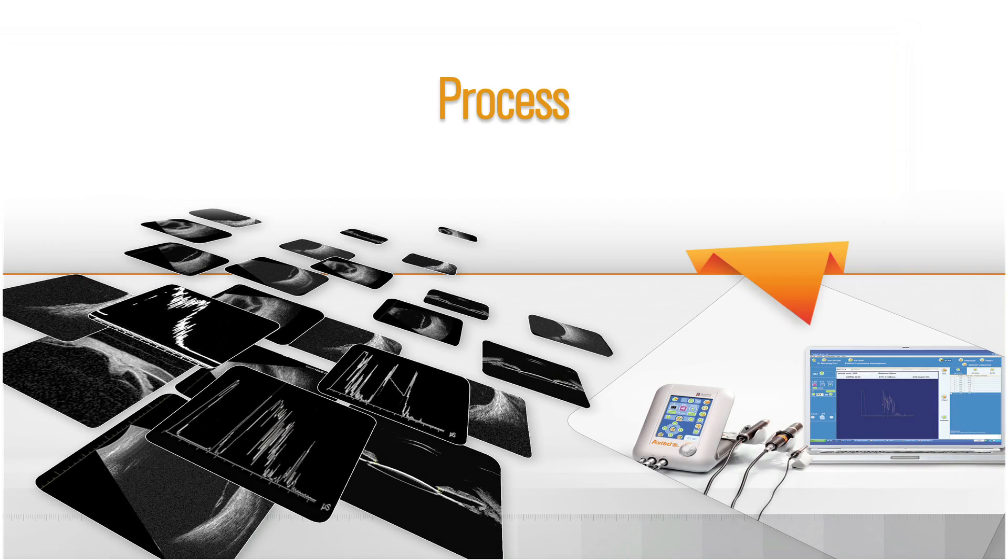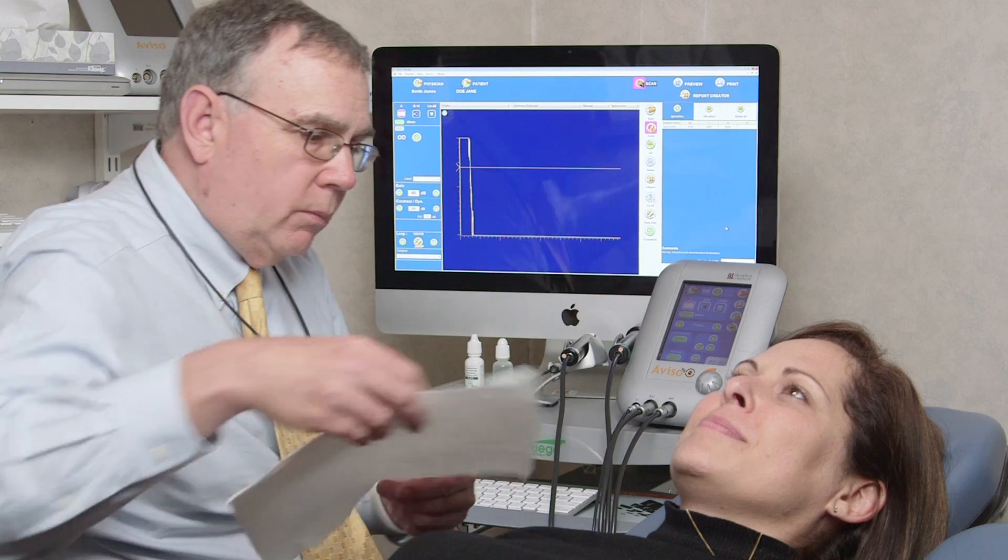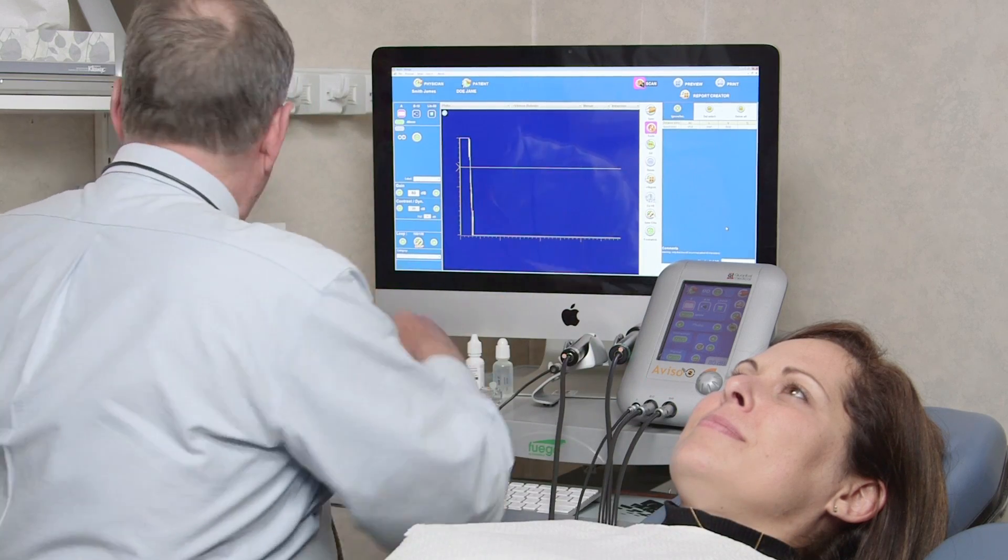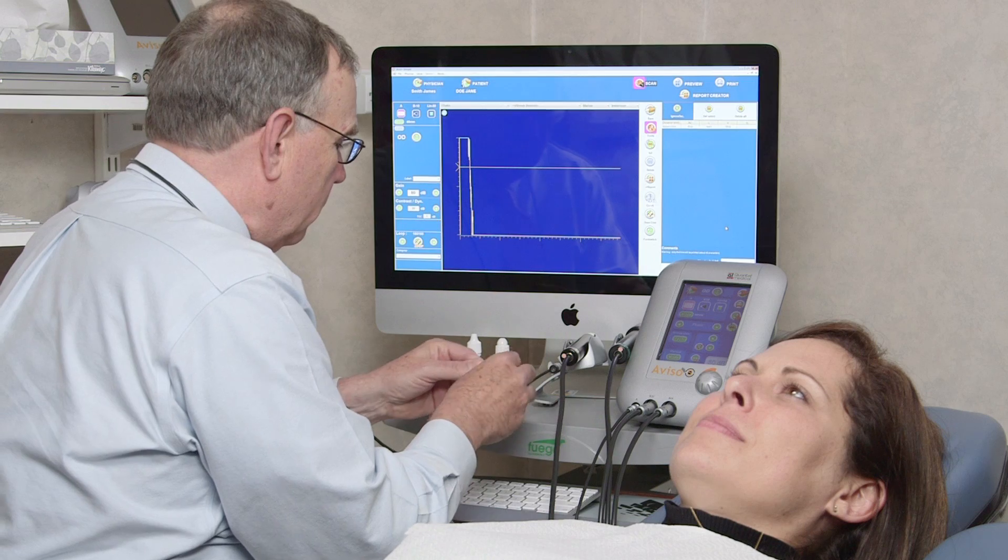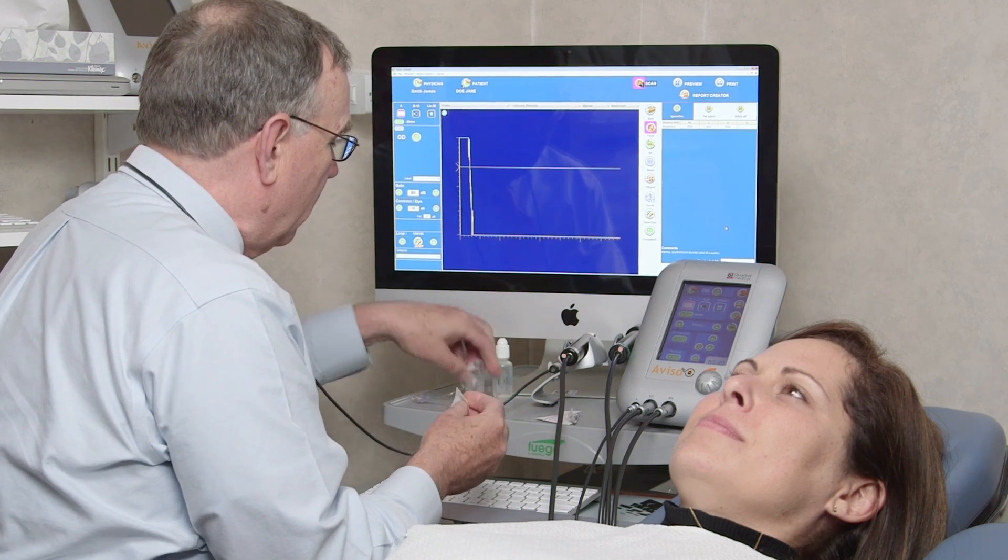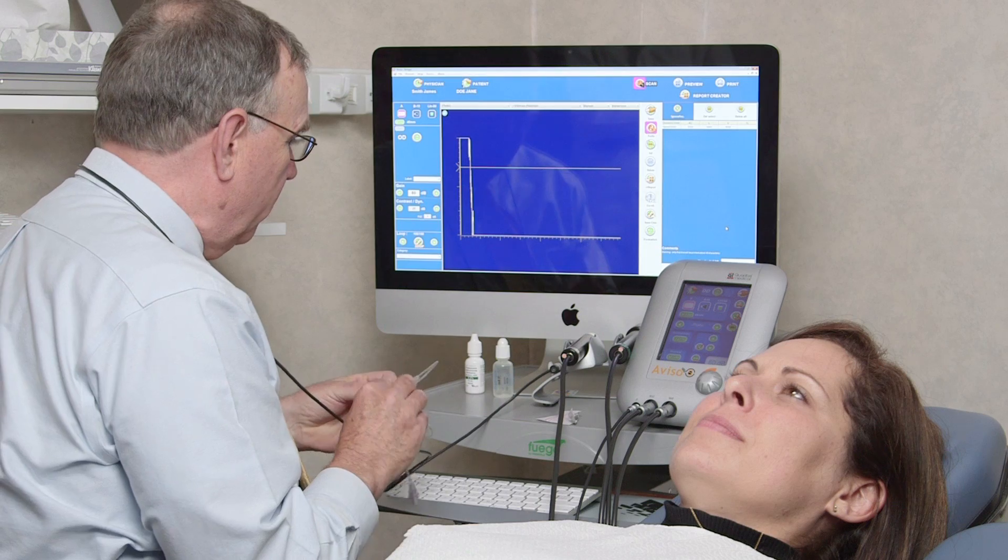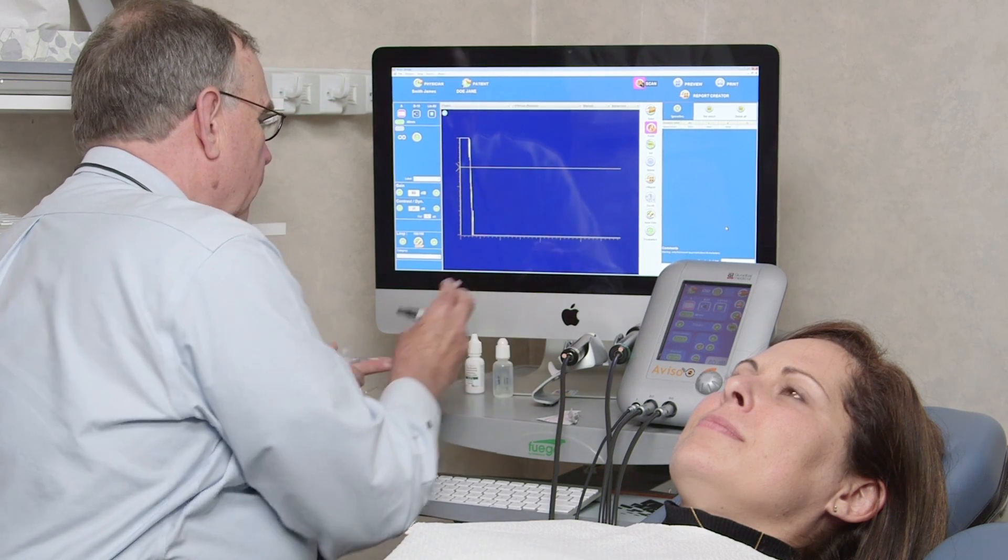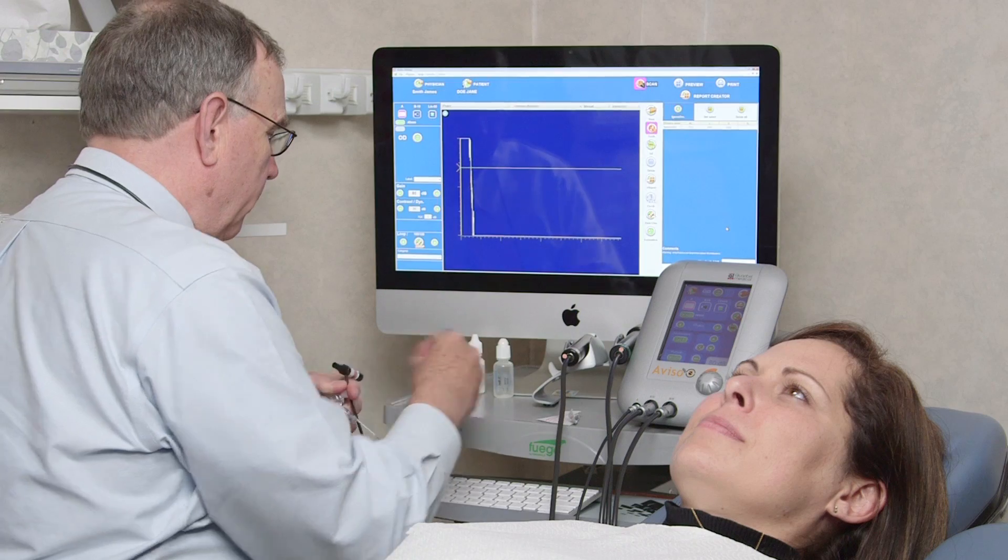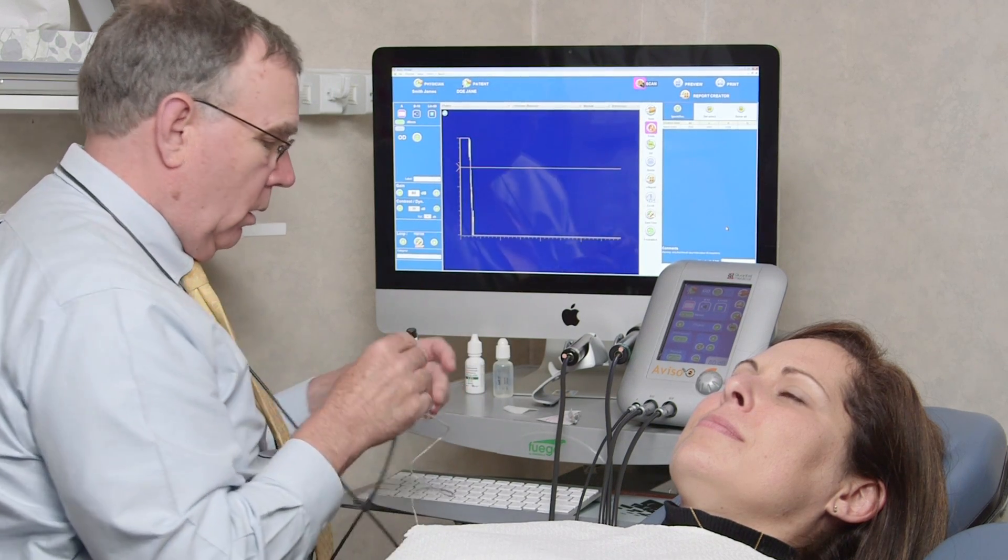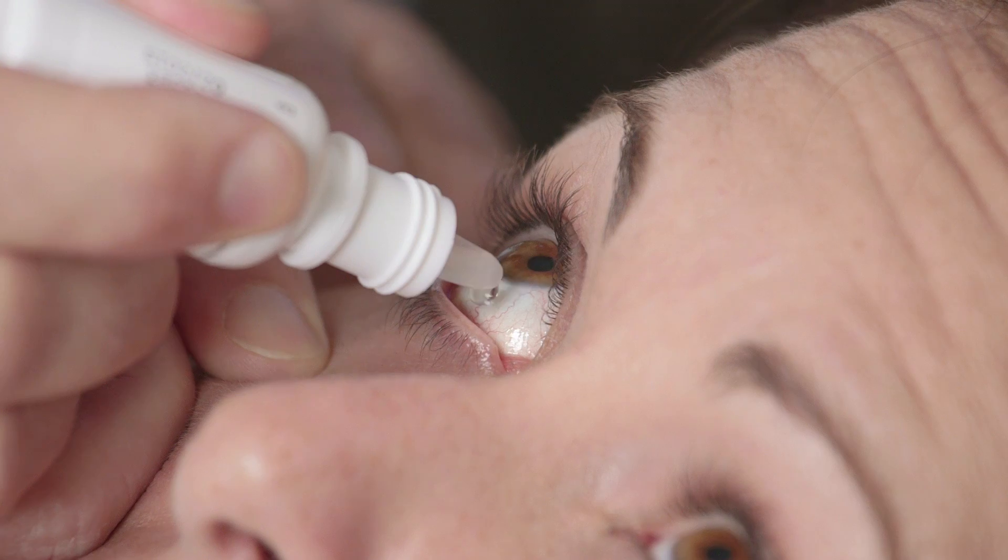Process. With that in mind, we turn to the process of performing A-scan biometry. First, explain the procedure to the patient and answer any questions to ensure they feel relaxed and ready. Obtain the patient's keratometry readings and enter them into the system. To perform either the contact technique or the immersion technique, the patient should be reclined. A topical anesthetic should be applied to both eyes.